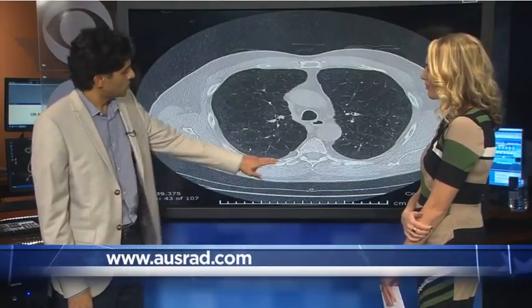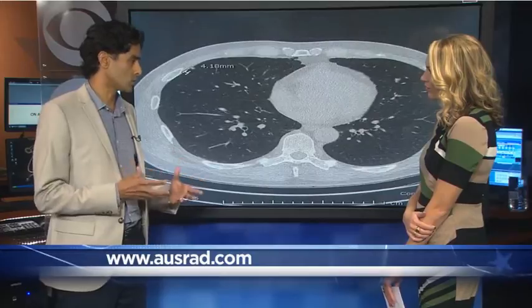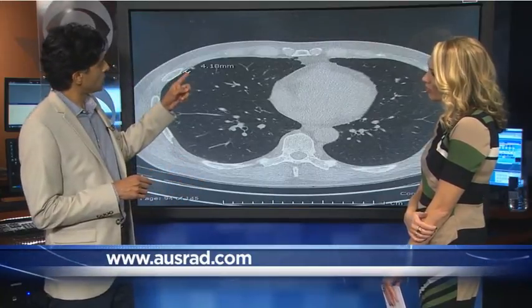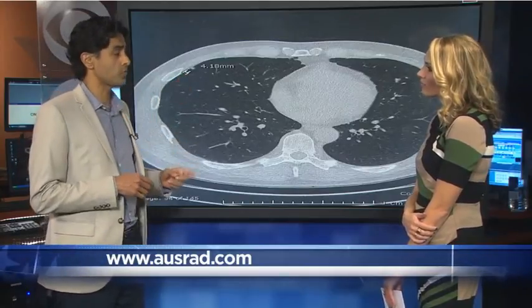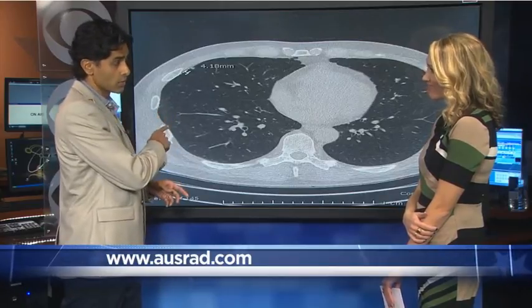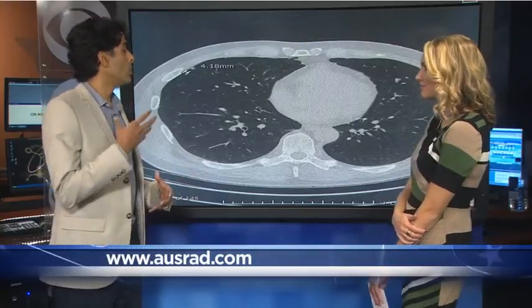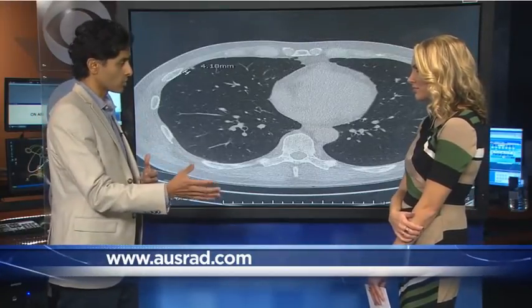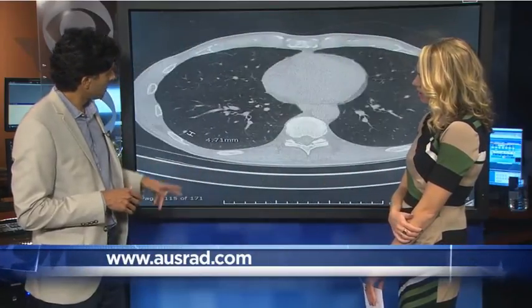Moving on, this is what we look for in these CT lung screening exams. The top of the image is a tiny 4mm nodule. When we see this, we can issue follow-up recommendations to make sure this tiny nodule doesn't grow up to be a lung cancer. Not all nodules are cancer, which is important to know, but we don't know unless we follow them over a certain period of time. Here is another example, a little bit larger at 5mm. Again, this will need to be followed up.